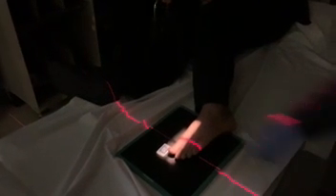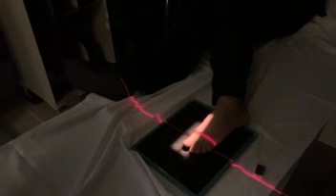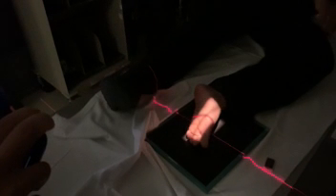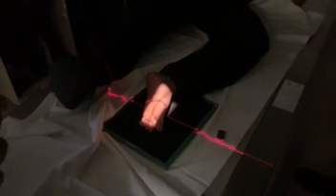Okay, so if we were doing toes 4 and 5, right, we would just turn the foot the other way, but it's the same idea. Now, Daniel, I'm going to have you turn your whole body towards me. Good. All right. You can stay just like that. So now we're going to be doing lateral toes.